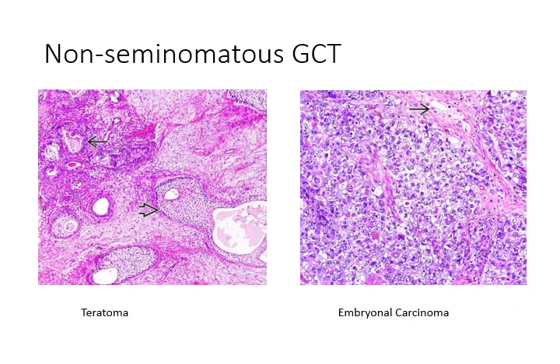So you've got some pictures of a non-seminomatous germ cell tumour. As I say, these are often mixed with a variety of patterns. So that teratomatous component, we've got a whole mixture of relatively primitive epithelial and mesenchymal elements, but we can still recognise vaguely what the embryologic structures are, whereas they're often mixed with embryonal carcinoma, which you can see on the right there. And this is just undifferentiated high-grade unpleasant malignancy.